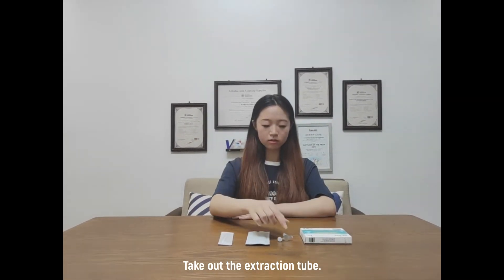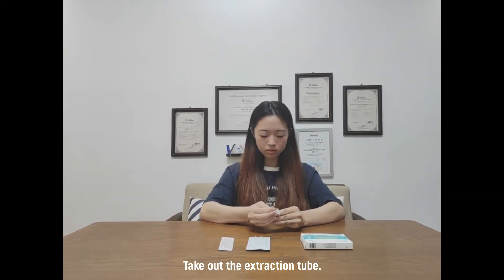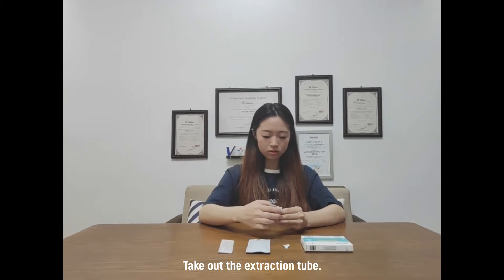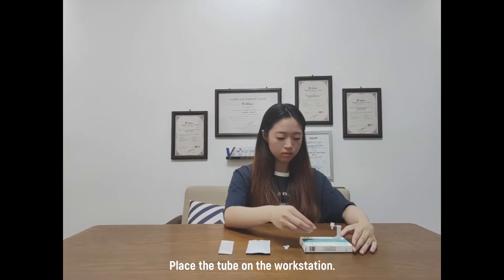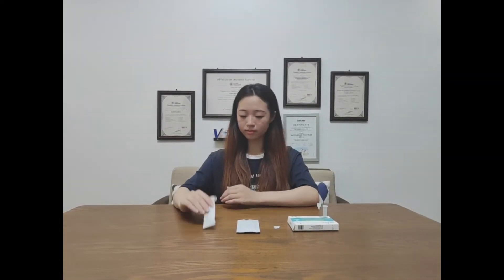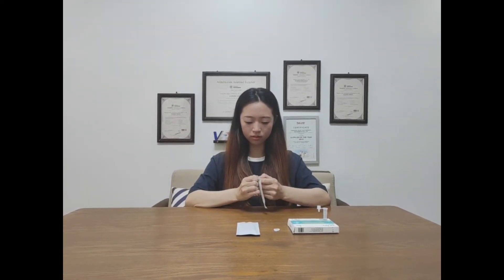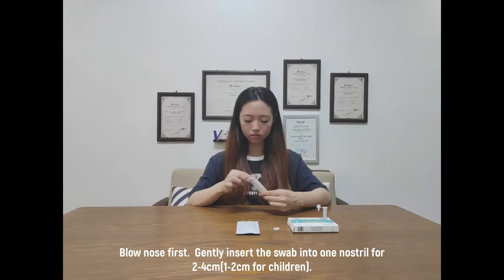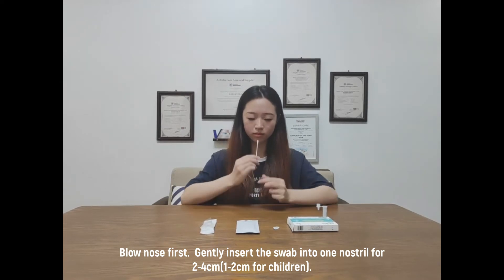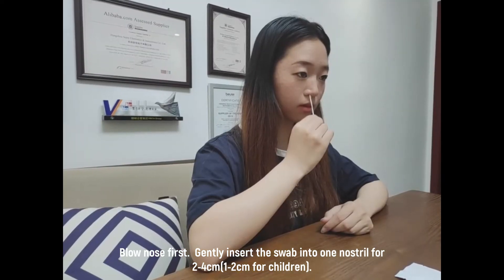Take out the extraction tube and place the tube on the workstation. Blow your nose first. Generally, insert the swab into one nostril for 2–4 cm, or 1–2 cm for children.